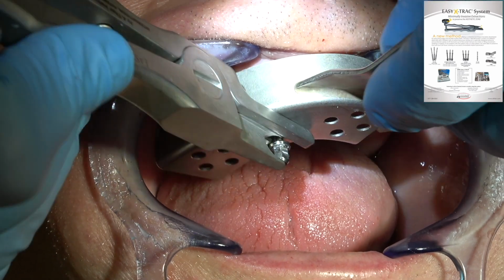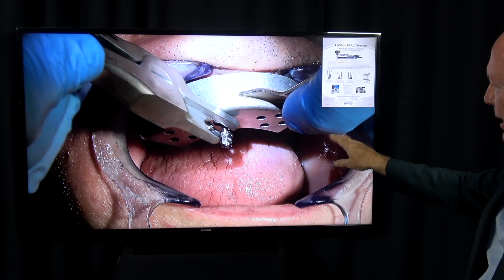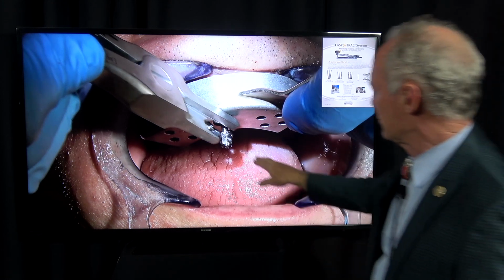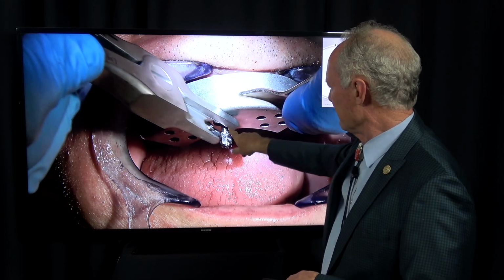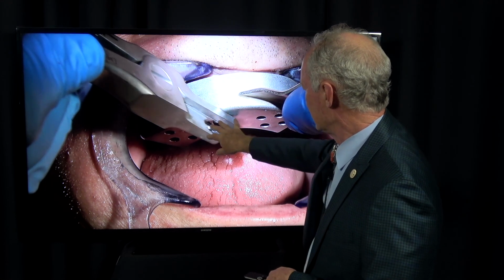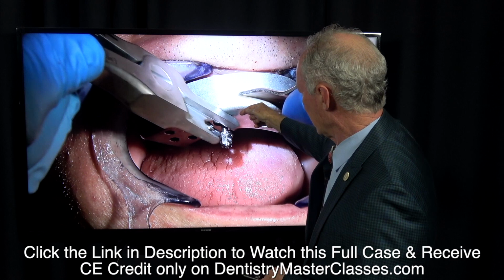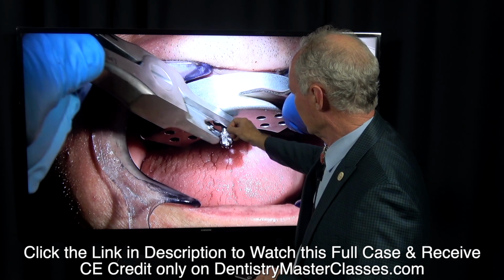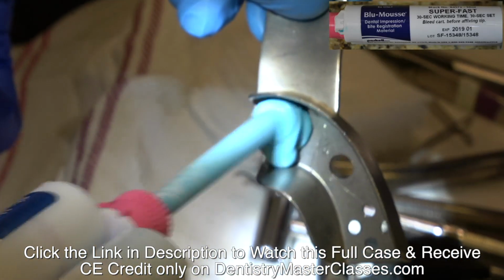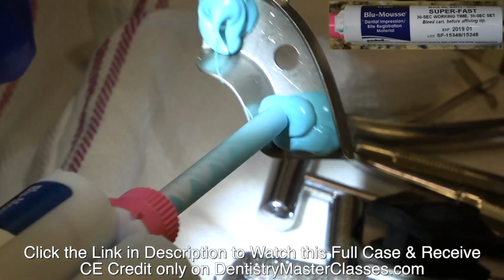Try this in the tray, and before you put the fast-set polyvinyl siloxane in the tray, try these teeth in the extractor to be sure you've got the tray seated so that there's not too much space. You want this to kind of squeeze in between the shoulder of the screw and the tray. You don't want a lot of space in here because this is going to open. So you want that to just barely squeeze in there. See how much space you've got, and then put the fast-set polyvinyl siloxane in the tray.